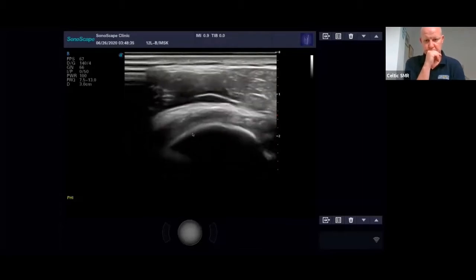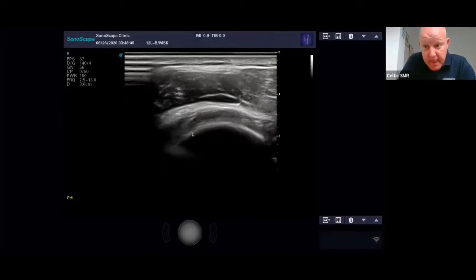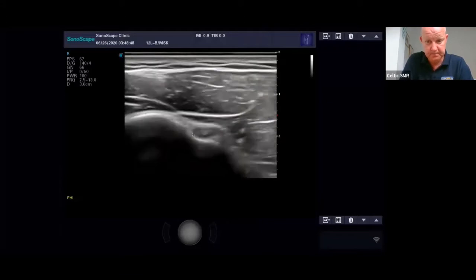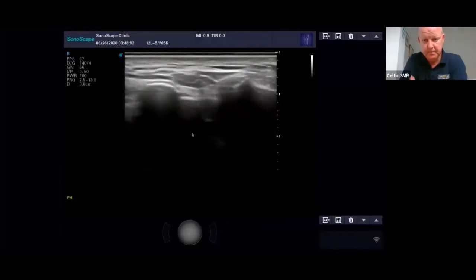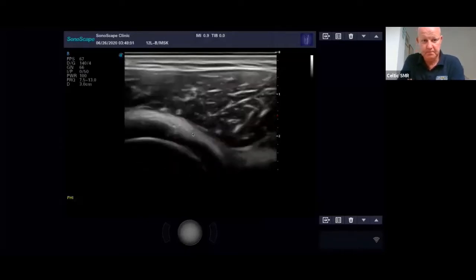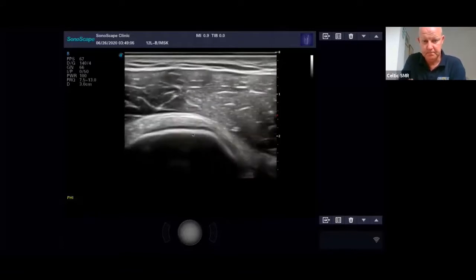Just trying to think if I've covered everything. Maybe do a recap for them, scanning the tendons in long and then short axis, from start to finish. So what I do is I come up onto the ACJ. Obviously, I'd have your arm behind the back. Come down onto the supraspinatus.